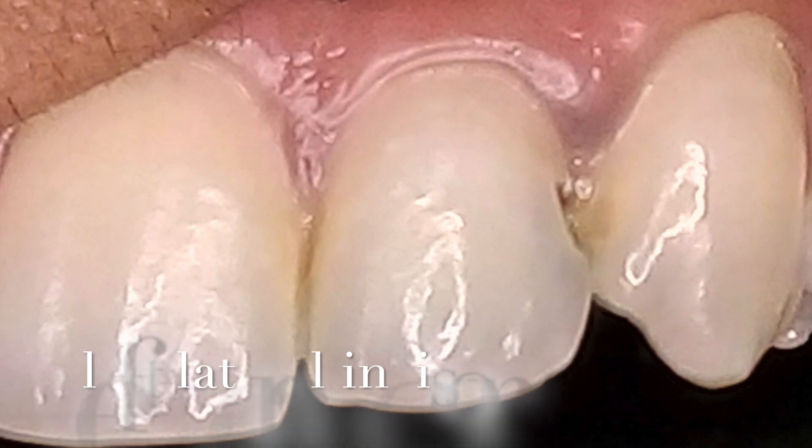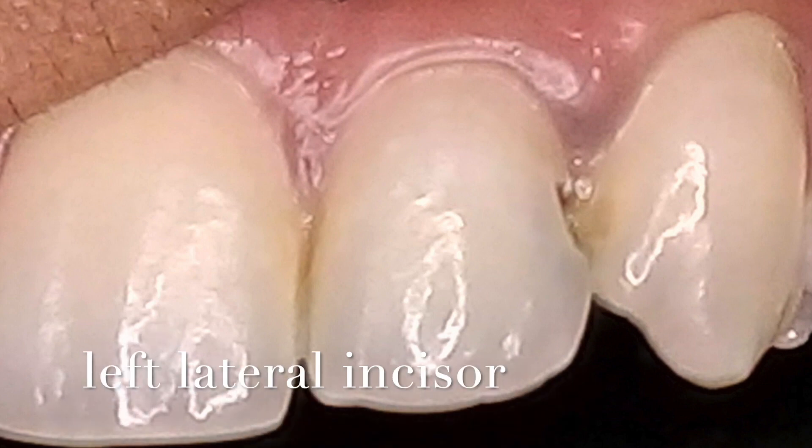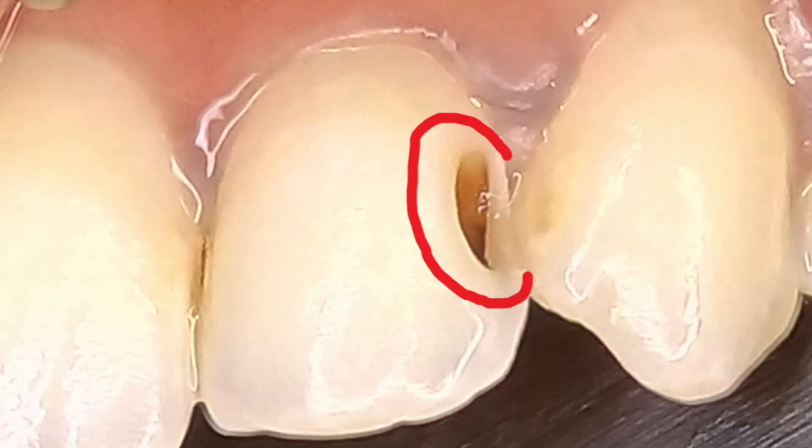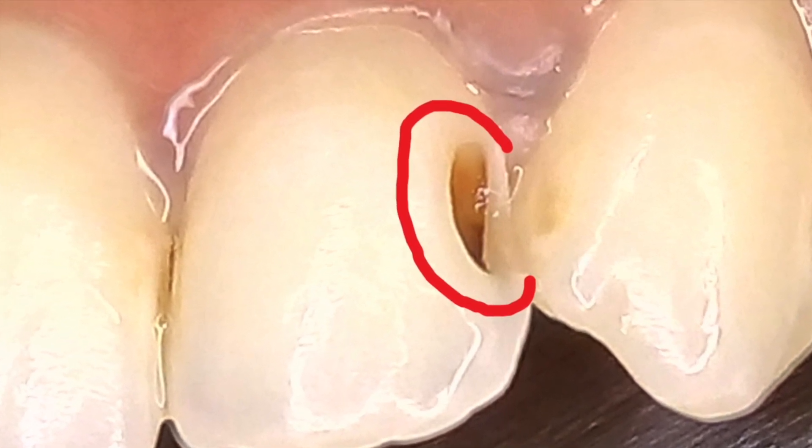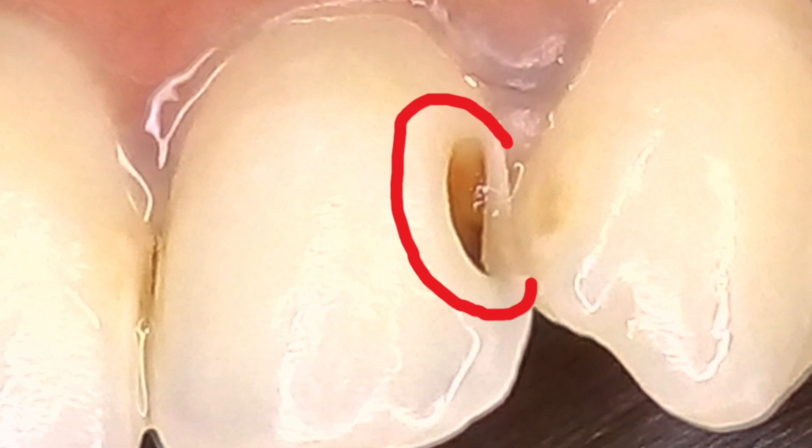This case is a class 3 on the left lateral incisor. If you focus on this outline form, traditionally this is what we've been taught — how to prepare a class 3 with minimal damage to tooth structure being paramount.